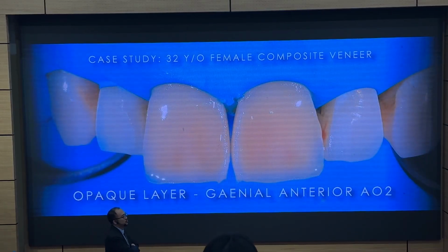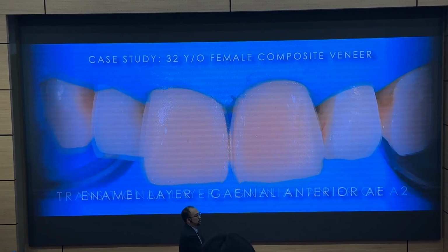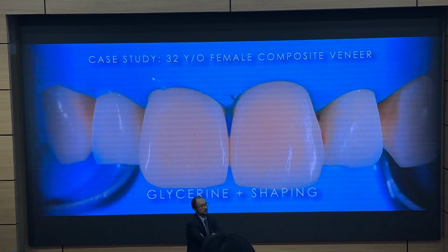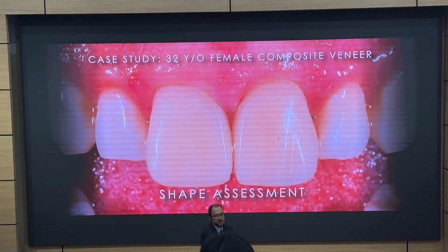This is AO2, A2, AE. Now, and you do your shaping, your polishing, and you assess.